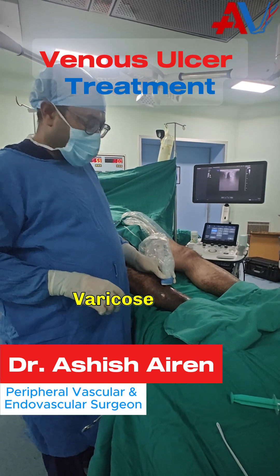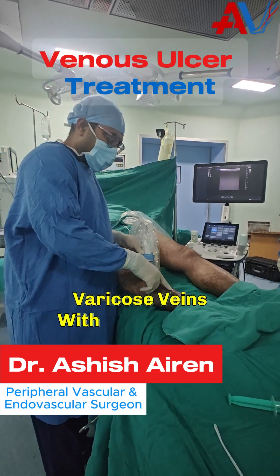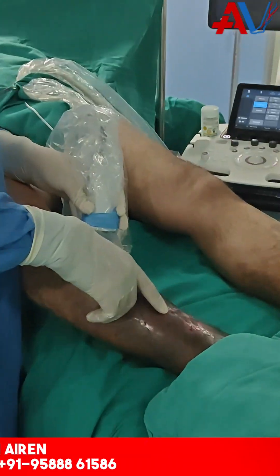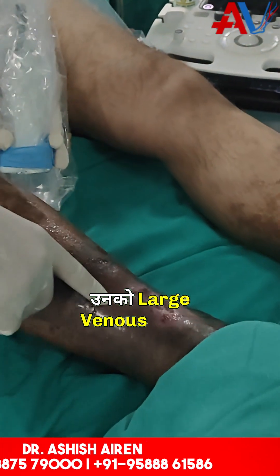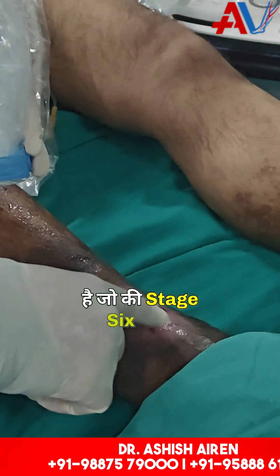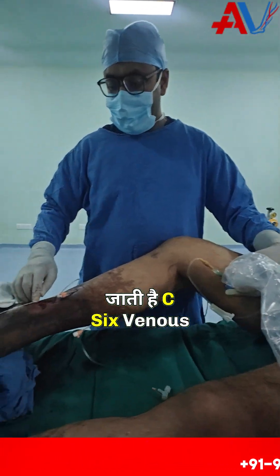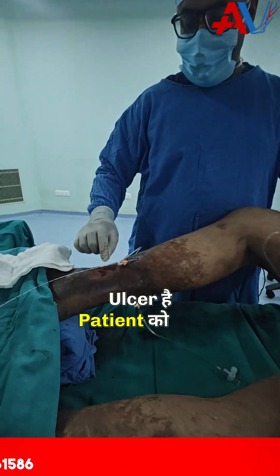The patient is a case of varicose vein with venous ulcer. It is a large venous ulcer because it is stage 6, C6. This is a venous ulcer for the patient.